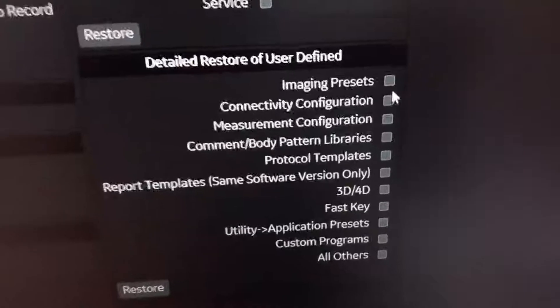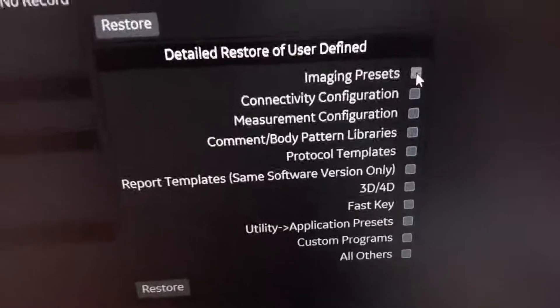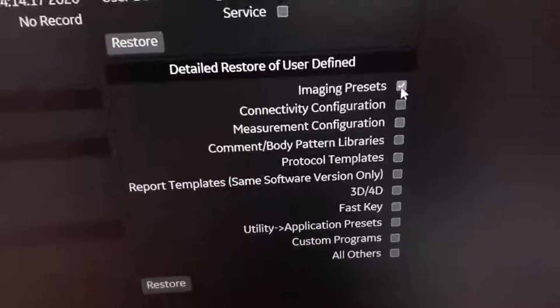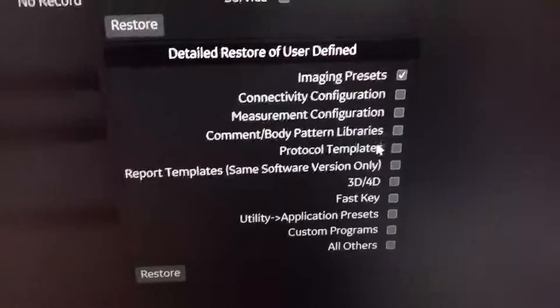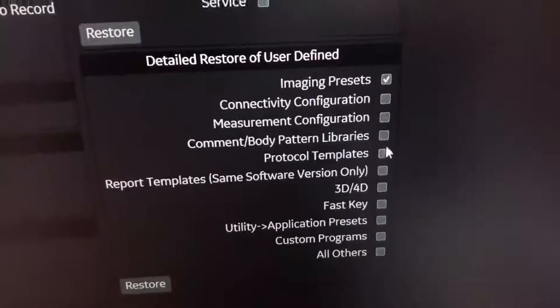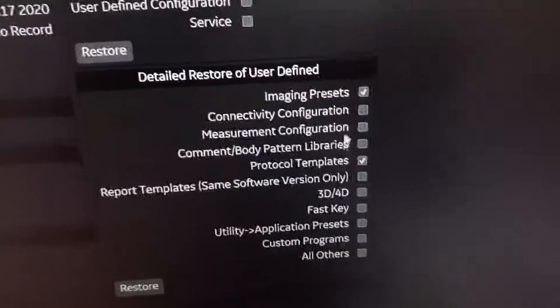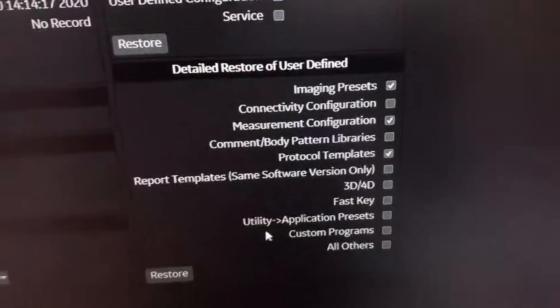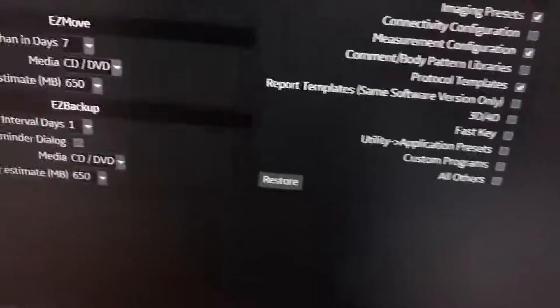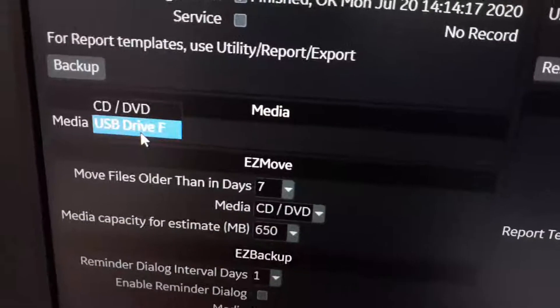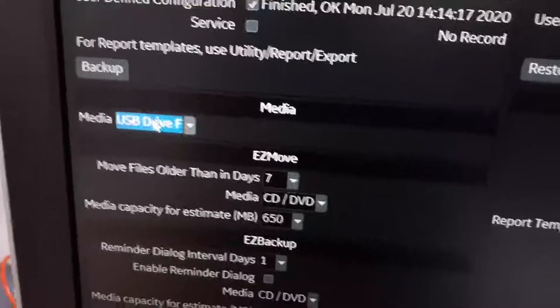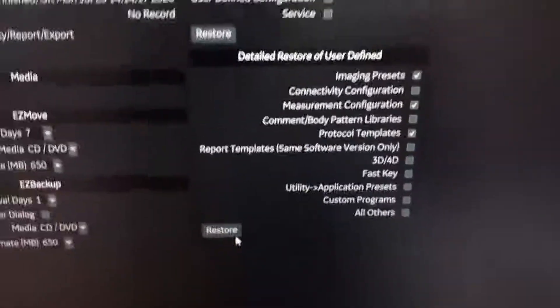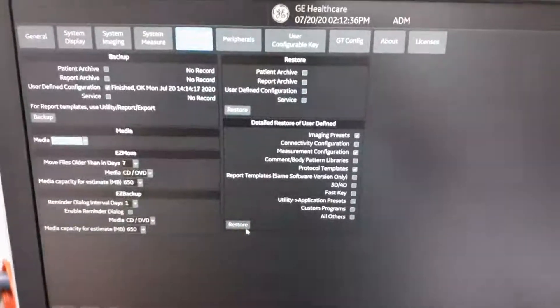If you only need specific configurations, select them here — such as imaging presets, templates, or measurement configurations — then press Restore. Don't forget to choose the media source as USB Drive, then press Restore and it will be done. Thank you.